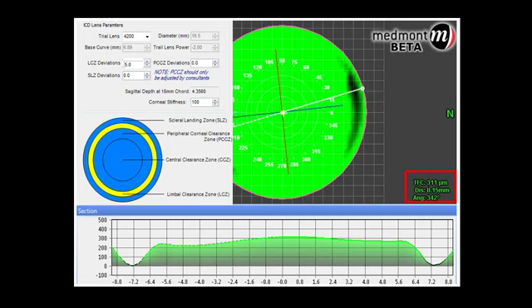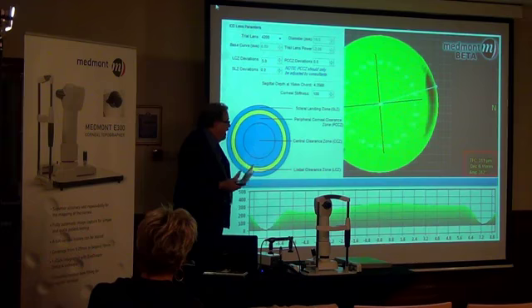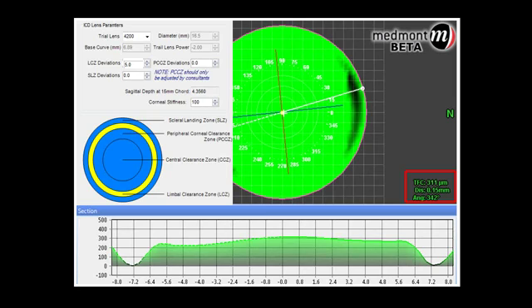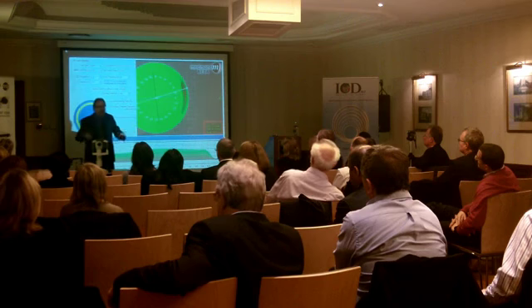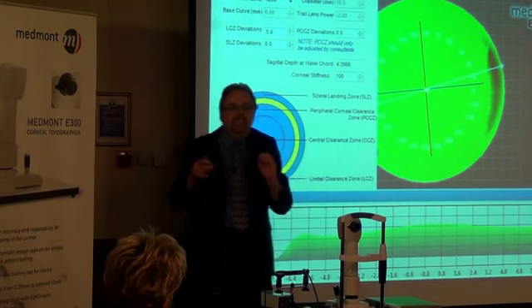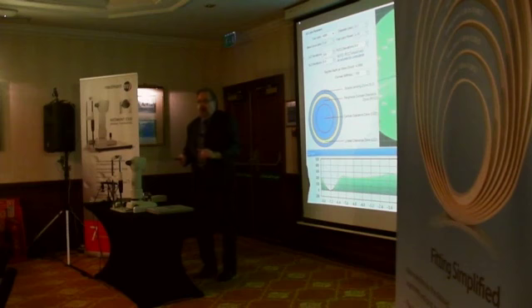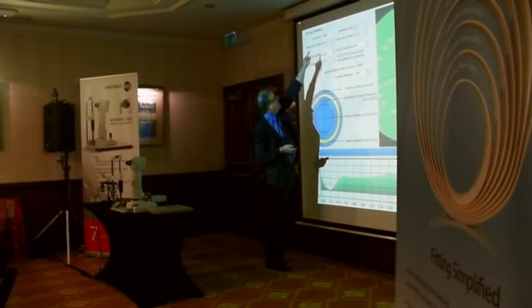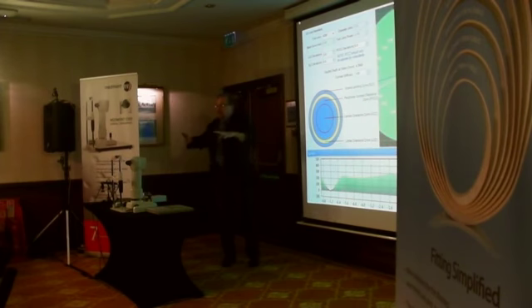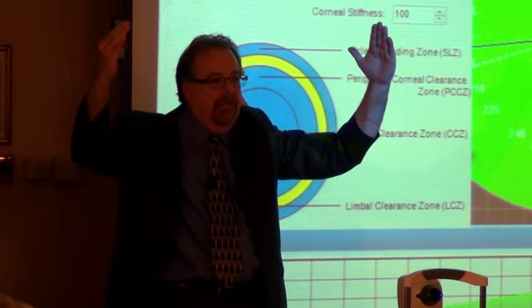So we're going to now simply go back to our 4200. We're going to leave the contact lens with that 5-degree angle, and now we'll have 311 microns of clearance. This is where we're going. All this is doing is helping you select the initial diagnostic lens. It's telling you, I can use that 4,200 micron lens, but this happens to be a patient that needs that extra 5-degree change in the periphery.